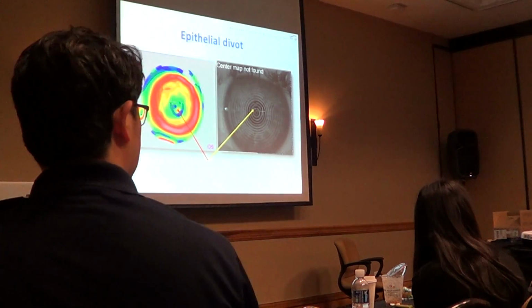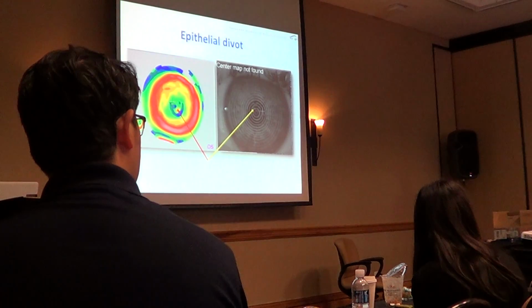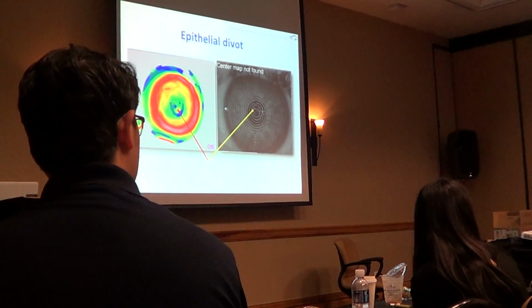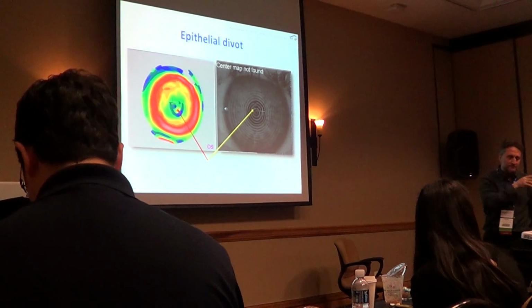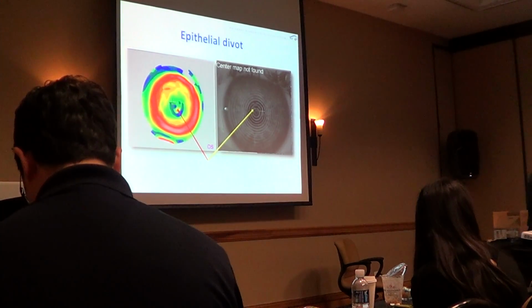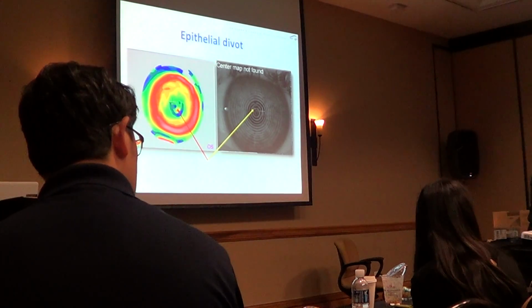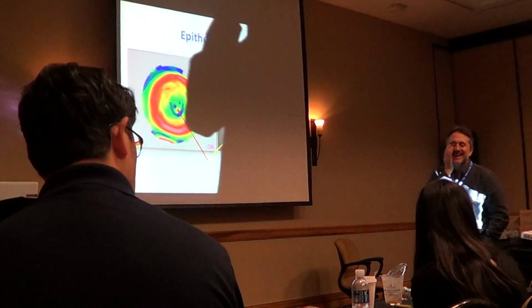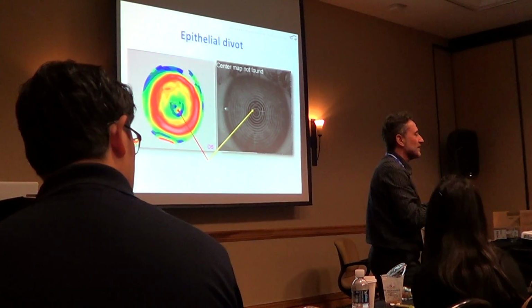So my question is how do you avoid this in the first place? Do you do a trial? You look at your topography, you think you're doing great, you take all your measurements and everything, and then... Okay, that's a question that someone asked me in the break.